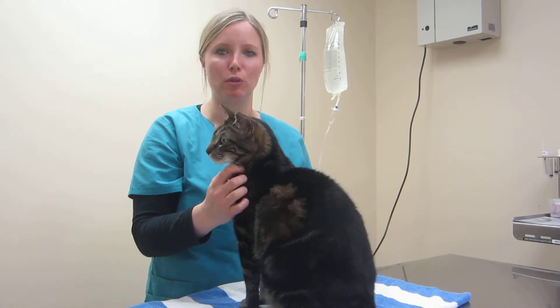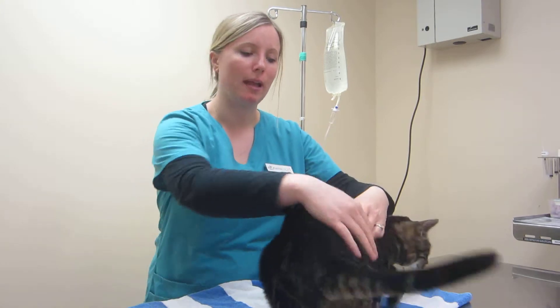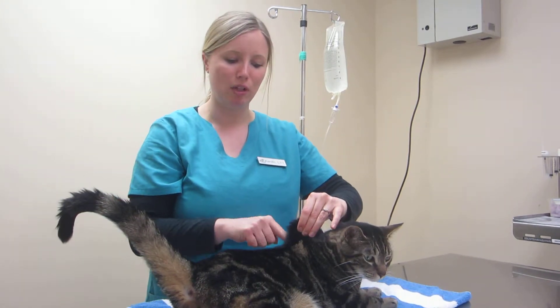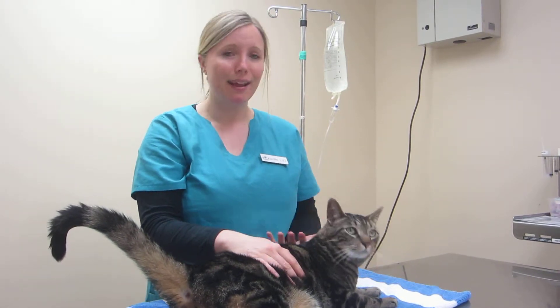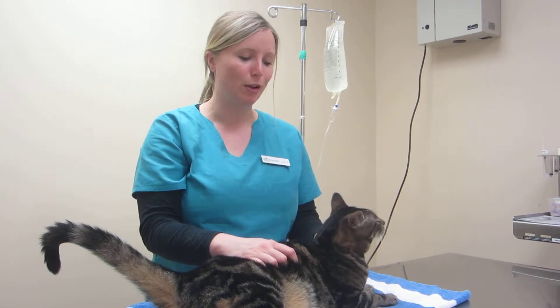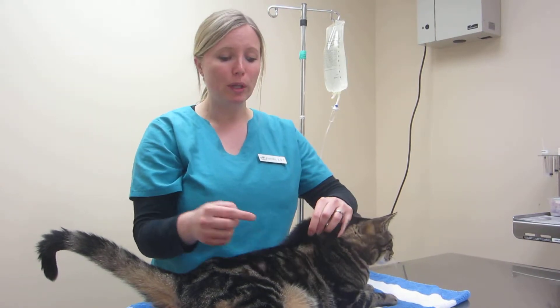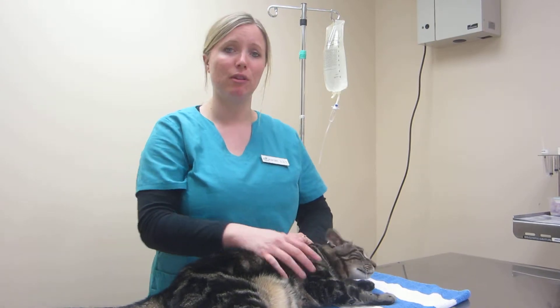Just calm down and do it again. The other thing that can happen is you can go a little too steep. The needle is long, so if your tent is not high enough and you go a little too steep, you can hit their muscle tissue, and that hurts. Also, it's not going to allow the fluids to flow really nicely — you're going to sit there for a long time to get those fluids in. So once your needle is in the tent, you want to have a nice free flow of fluids.